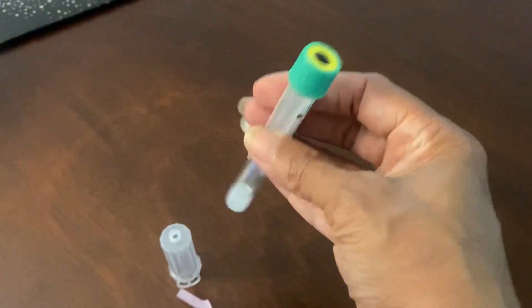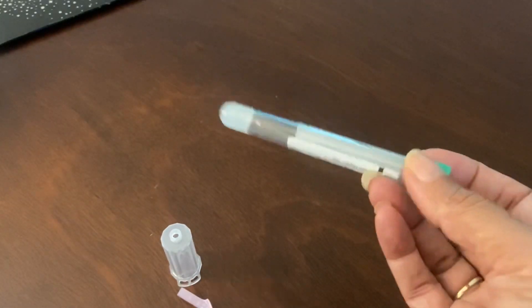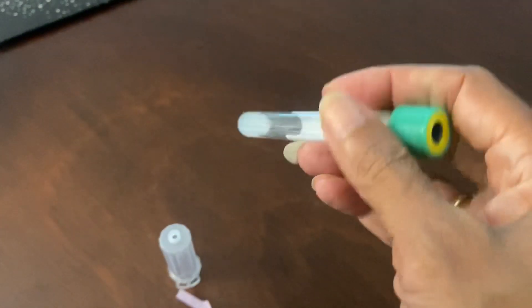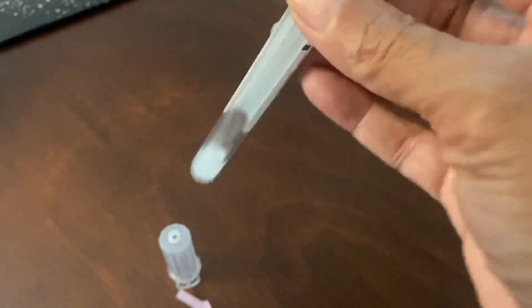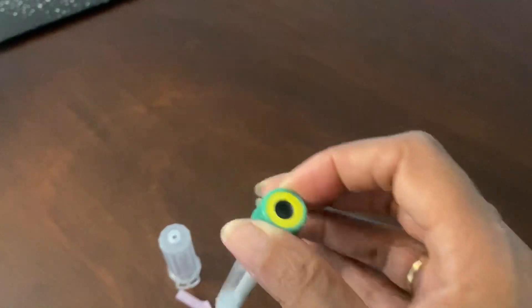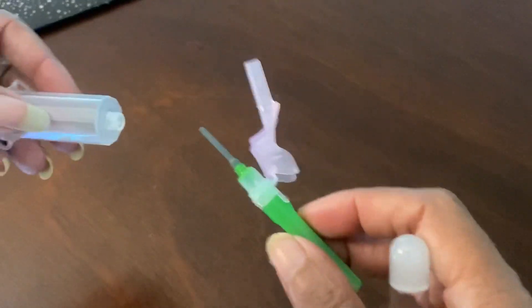That's why it's important to let the tubes fill on their own. Once you stick the vein, make sure you allow the tubes to fill up and stop on their own — that's why it's an evacuated system. When it stops, it's good. You don't remove the tubes from the holder because you think it looks like it's enough. You let them flow and stop on their own.